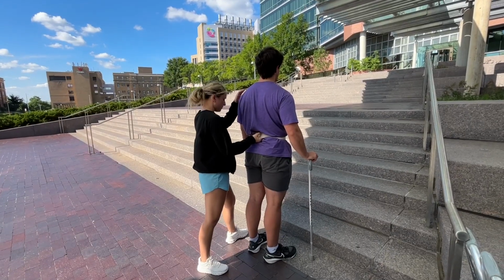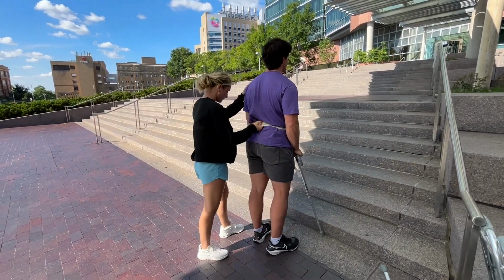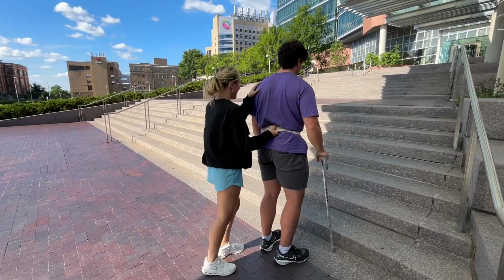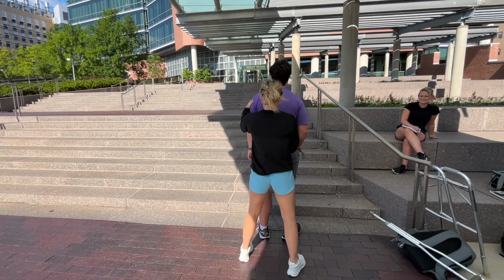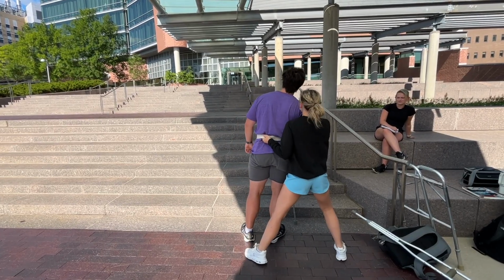If the patient loses balance while trying to walk up or downstairs with a cane, the PT or caregiver should use the same guarding techniques as described with the crutches. With any direction of loss of balance, the PT should remain close to the patient so that they can use their strength to prevent the patient from falling. This can be done by grabbing onto the shoulder, trunk, or pelvis while making sure to keep one hand on the gait belt at all times.